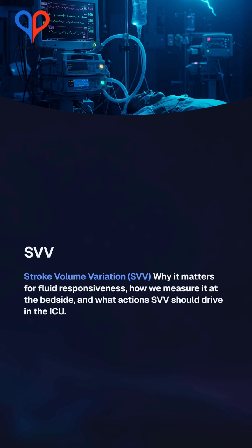Today, we'll focus on stroke volume variation, SVV, a dynamic, physiology-based metric that helps answer the question every intensivist and anesthetist faces. Will this patient respond to fluid? We'll cover the calculation, how SVV is identified using an arterial line and pulse contour analysis when the values are reliable, and the interventions to take when SVV is high or low.